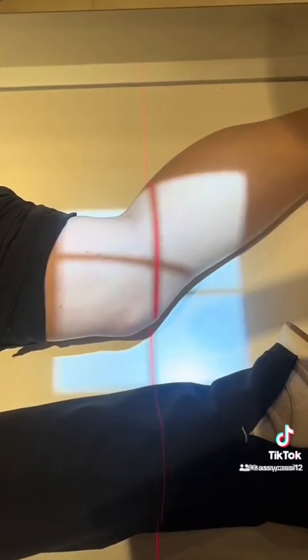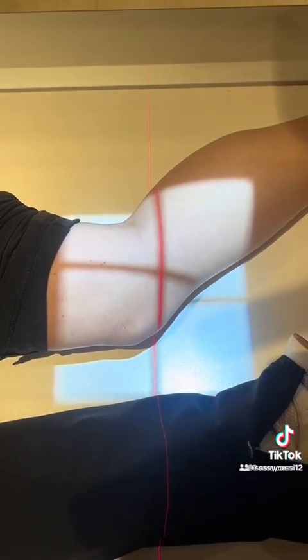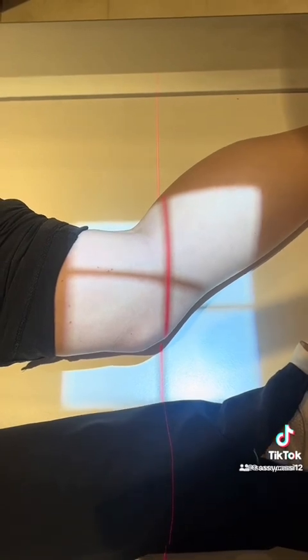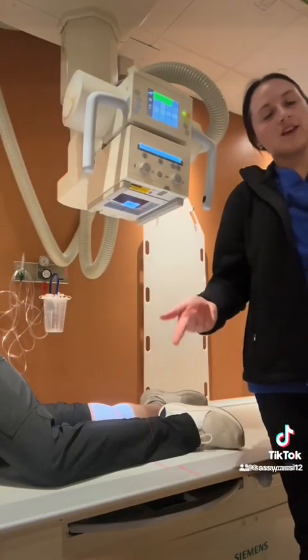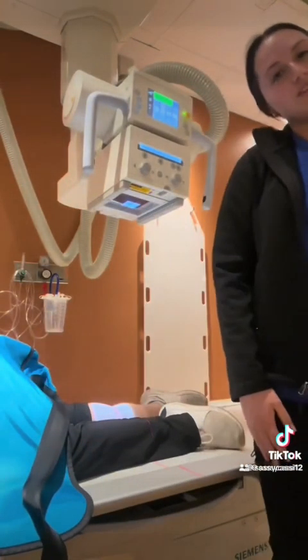The centering point for a lateral knee x-ray is 1 inch distal to the medial epicondyle. And your collimation is to include all 4 sides of the area of interest, including the soft tissue margins. And then I place my right marker. So now before I go back and expose, I'm going to shield Shelby again, over top of her. And then I just tell her to hold still.